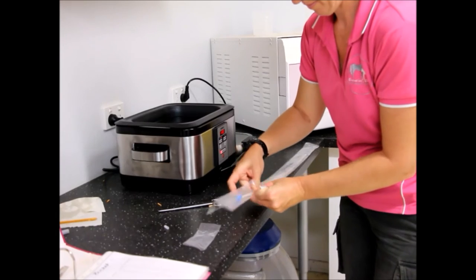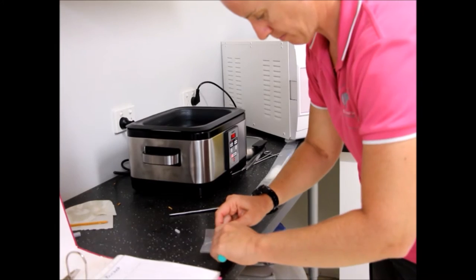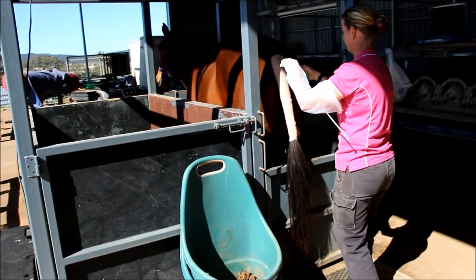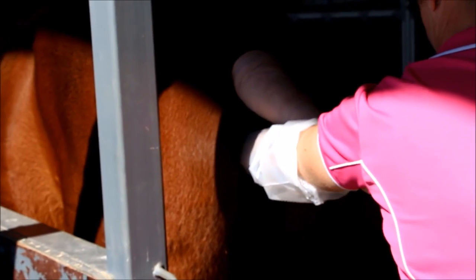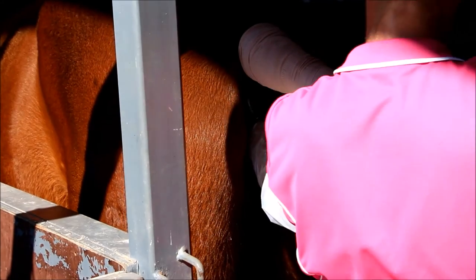Once that's loaded, we go out to the crush and inseminate the mare, which involves going into the vulva and inserting the semen — the same basic process as chilled semen. The key difference is that with frozen semen we put the AI pipette a lot further in, going all the way up the horns. With chilled semen we just deposit it into the uterus just past the cervix, whereas with frozen semen we take it all the way up the horns to where the fallopian tubes are located.